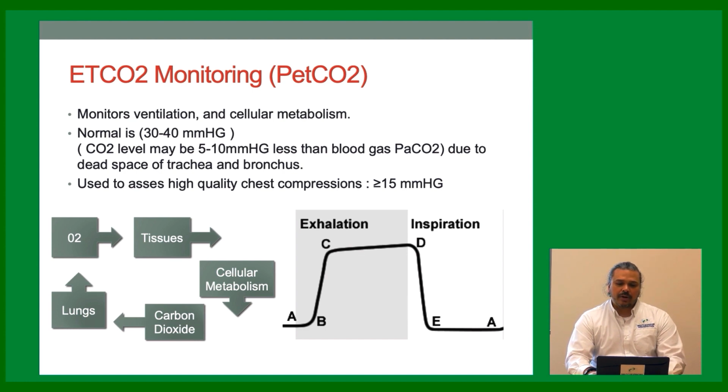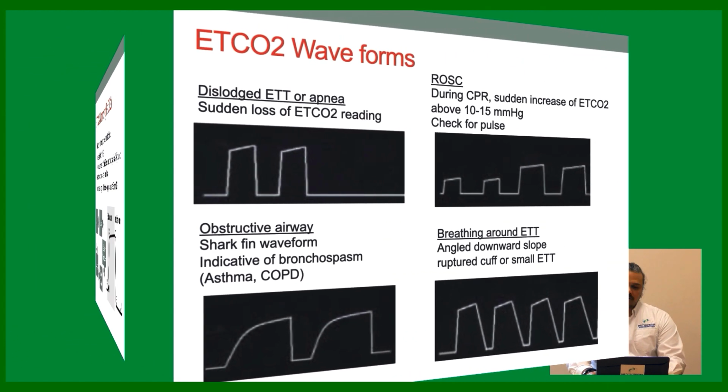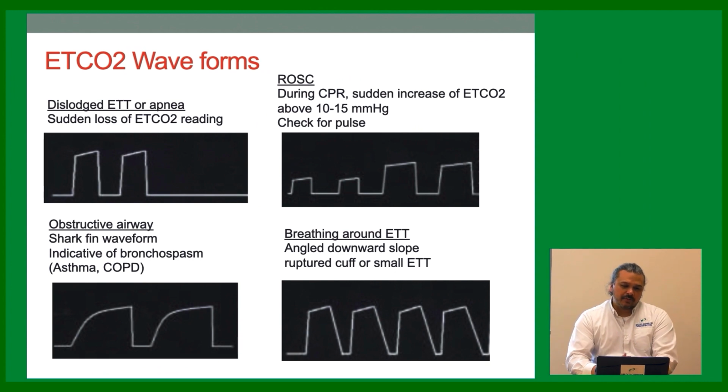Our waveforms look like this. They're kind of box shaped, and if we get this waveform, it means we're getting a good, consistent reading. Now there are different types of waveforms that we'll look at.